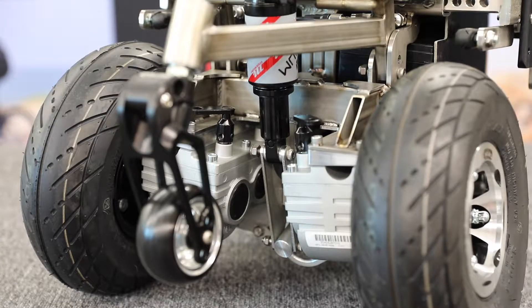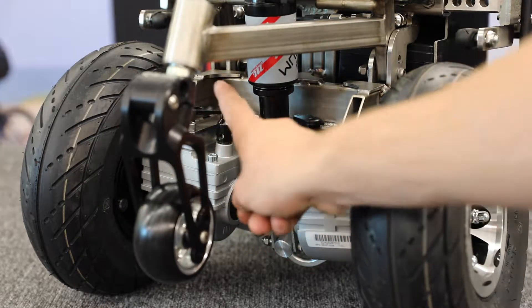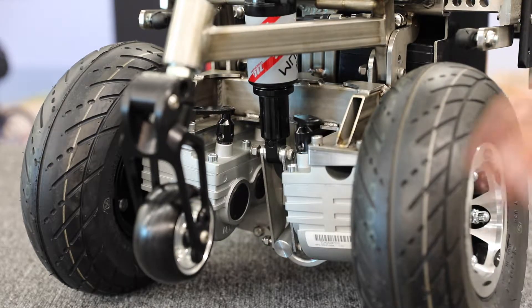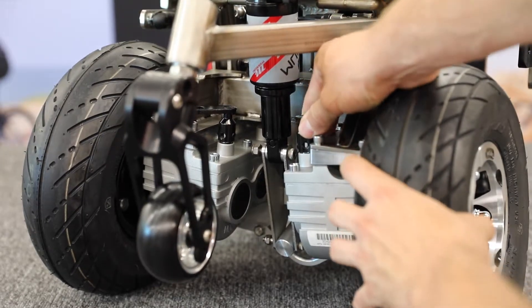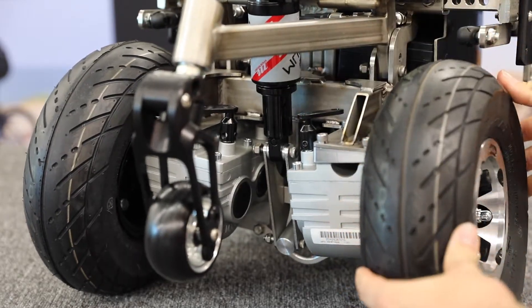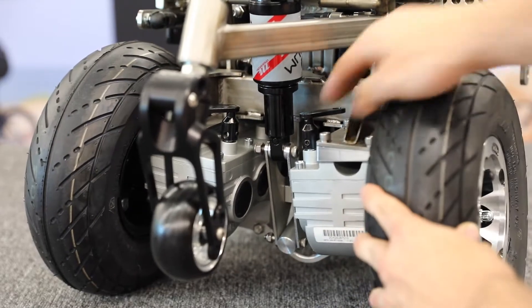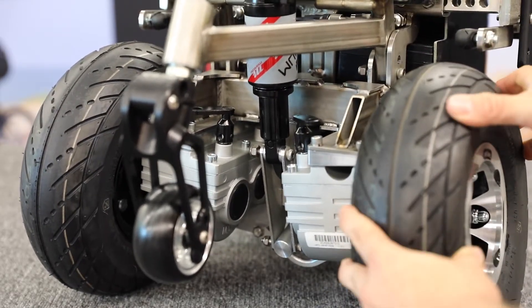First, the motors of the ZX-1 have black levers on them that engage and disengage from what we call freewheel mode. Those levers are located right here and right here. The motor levers are in the position pointing forward, and if you move it backwards that disengages the motor and allows the wheel to spin freely. Putting the position back forward then locks the motor in.